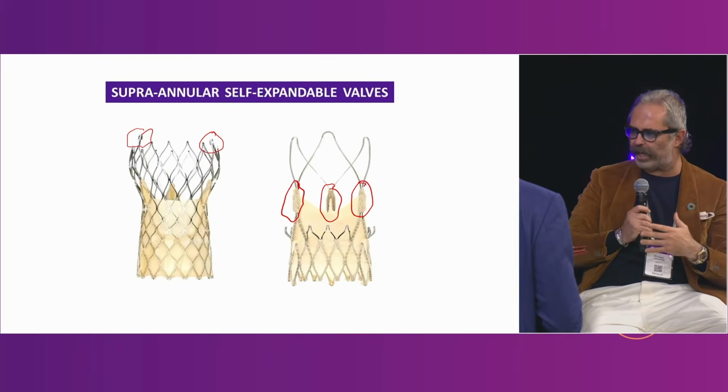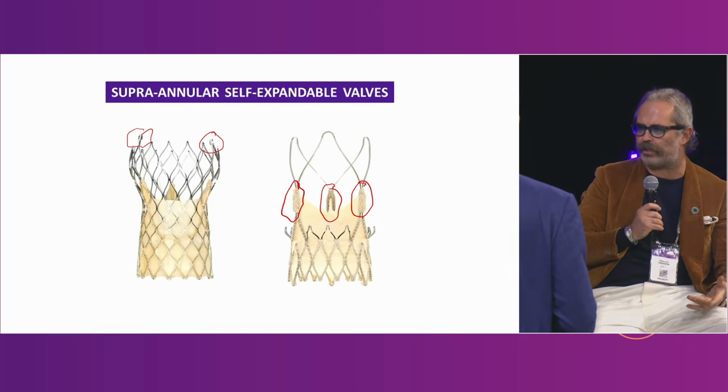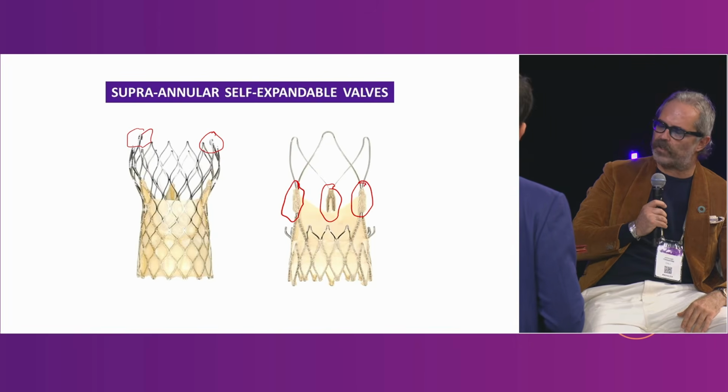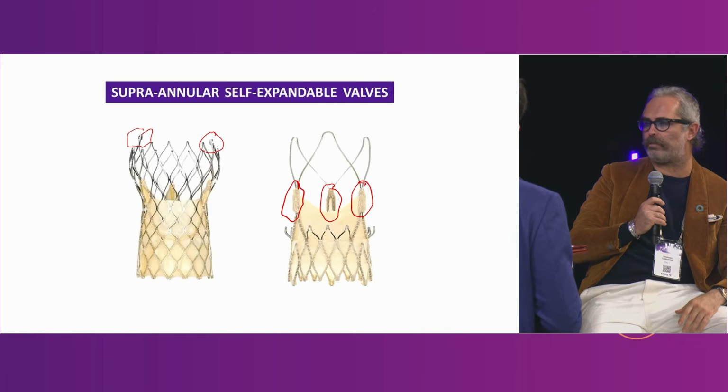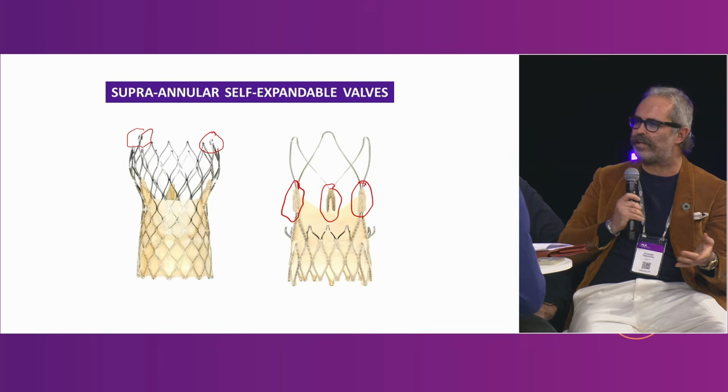So for me, the default strategy is to orientate, and for sure, not all the self-expandable valves are the same. There are some, like the Accurate Neo in this case, that are easily orientable. There are others that do not have marker beads. It's a little bit more difficult and tricky. You need to go with close-up, what are the things to orientate. But for me, it's very important because this is mainly grounded in surgical science. They don't have any valve that is not oriented. So I don't understand why we should go for a non-oriented valve.